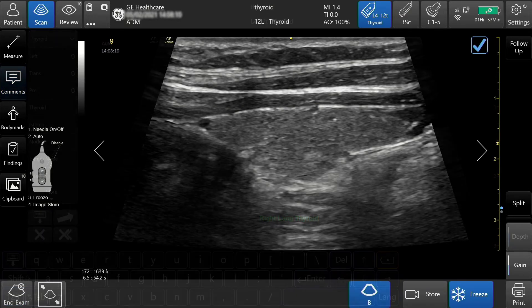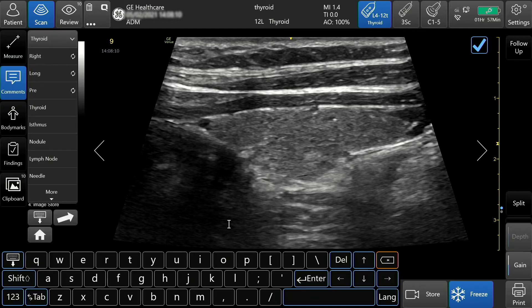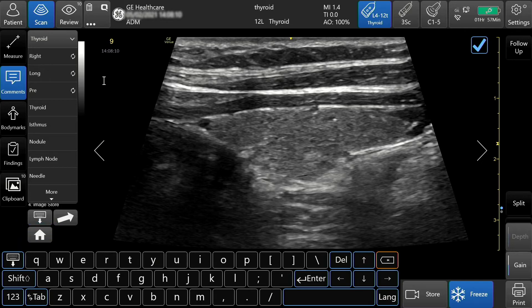To set the comments home location, tap comments. Move the cursor to the desired location, then tap the home icon. This will set the default location of your comments.